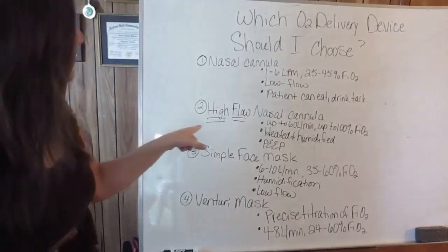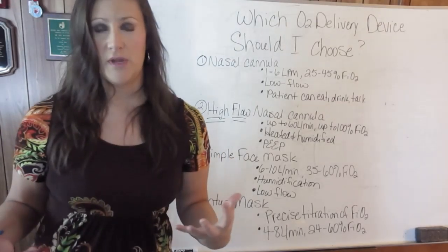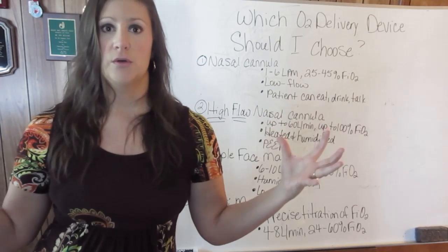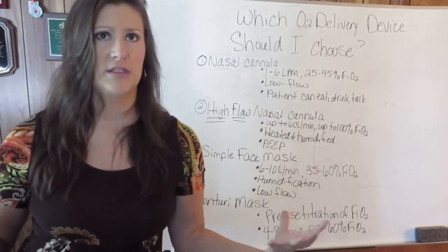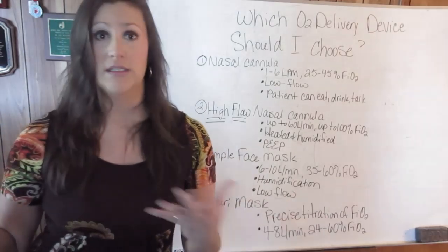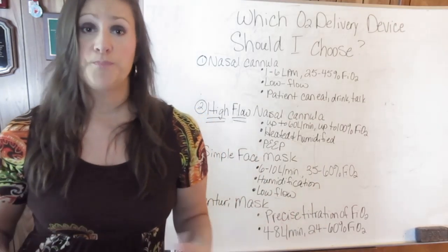Now, the next thing I have mentioned, number two, are the high flow nasal cannulas. And this one provided me with so much confusion when I was in nursing school. I'm like, what is the difference? Okay, the patient's on a high flow nasal cannula. I don't know what that means. I know the tubing is long and green, but that's about all that I know.